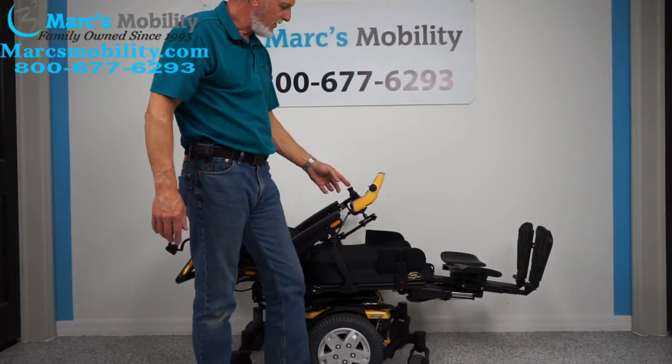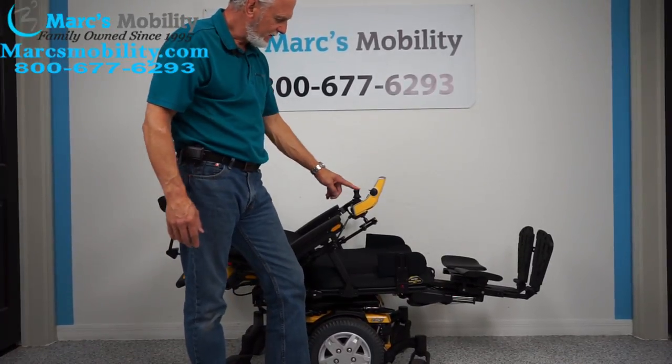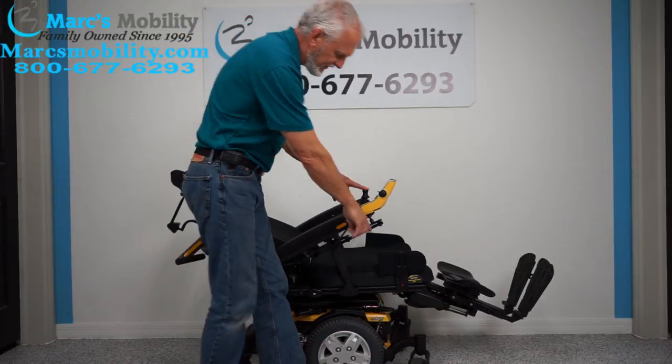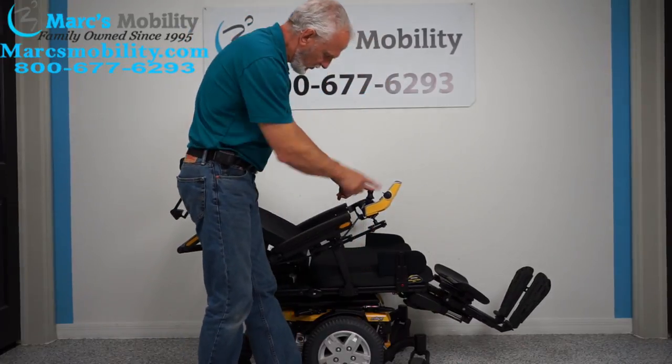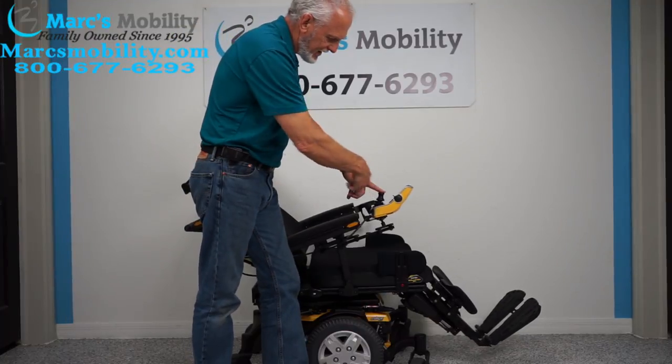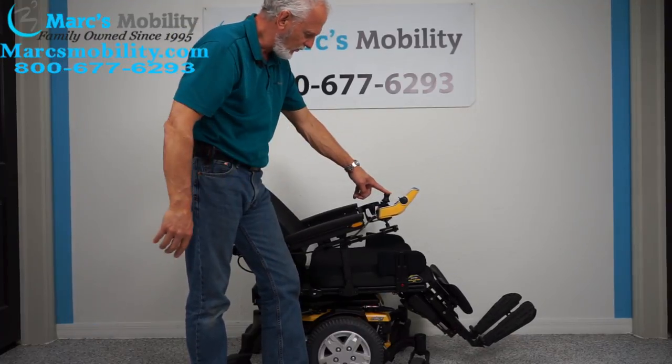Now I'm going to bring the back up and the legs down at the same time. You can see the legs are going down and the back's coming up because I've got the seat and back both yellow on my screen, and I'm pushing the joystick forward to make all this happen in one motion.